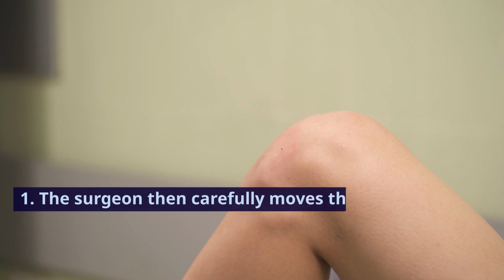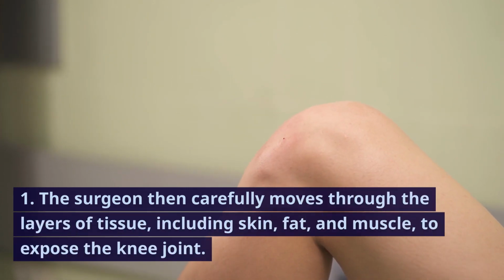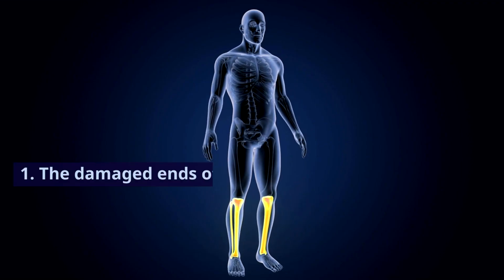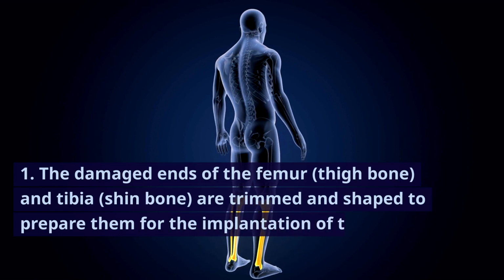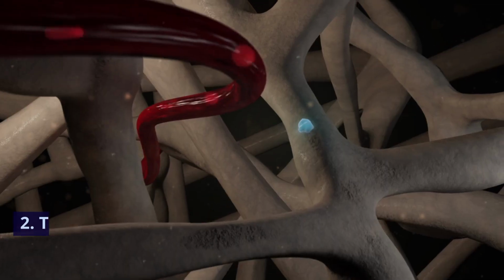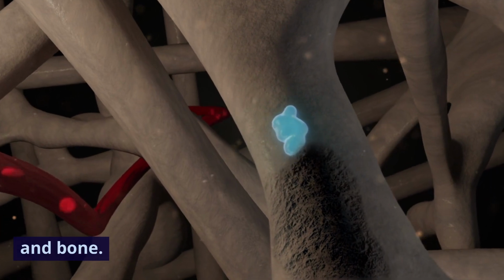The surgeon then carefully moves through the layers of tissue, including skin, fat, and muscle, to expose the knee joint. Reshaping the bones. The damaged ends of the femur (thigh bone) and tibia (shin bone) are trimmed and shaped to prepare them for the implantation of the prosthetic components. This involves removing the damaged cartilage and bone.